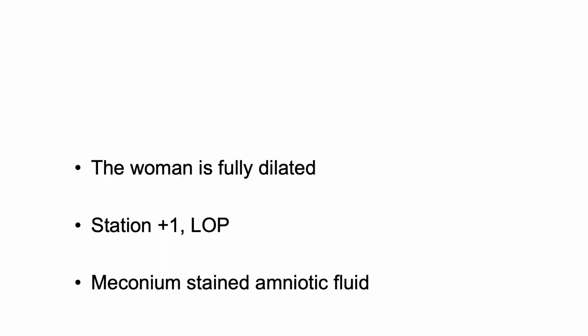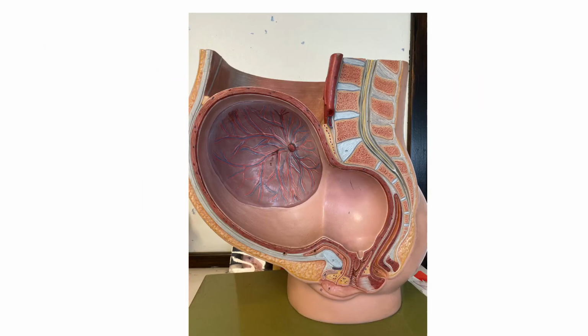The woman is now fully dilated. The station is at +1 in the left occipito-posterior position, and there was some meconium staining of the amniotic fluid.